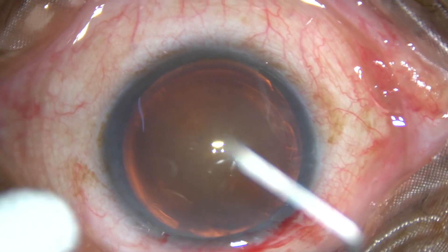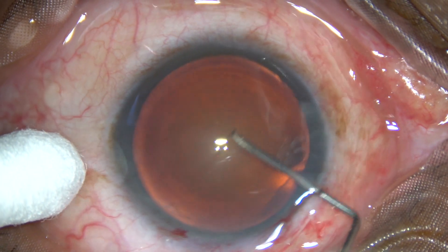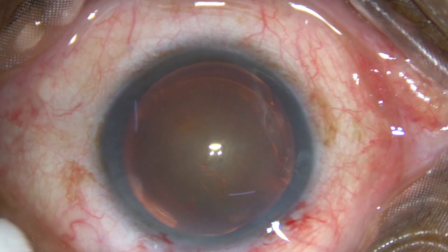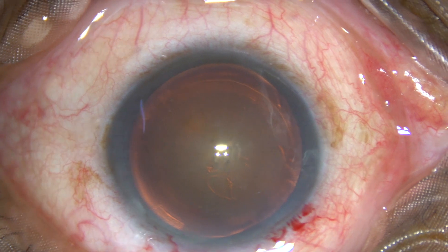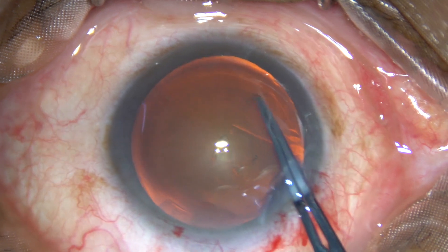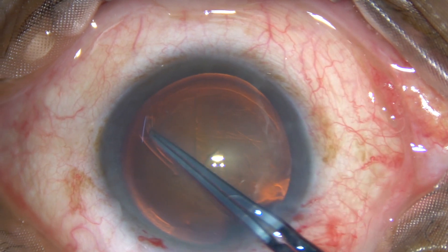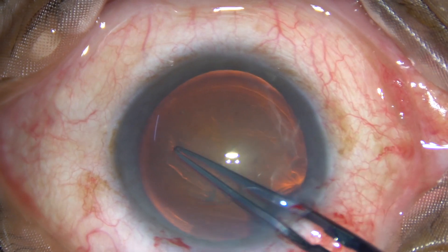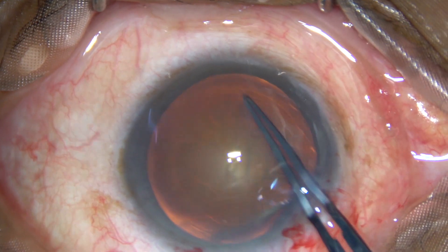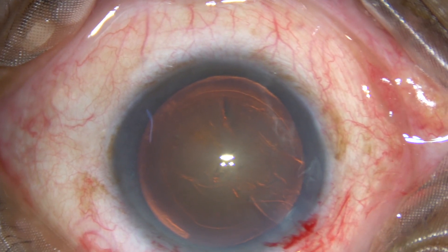The anterior capsule is incised with a 26-gauge bent needle and a capsular tag is raised. I take a Utrata forceps, hold this capsular tag, go anticlockwise, and try to remain at a certain distance away from the margin of the dilated pupil all around, thus completing a fairly acceptable capsulorhexis.